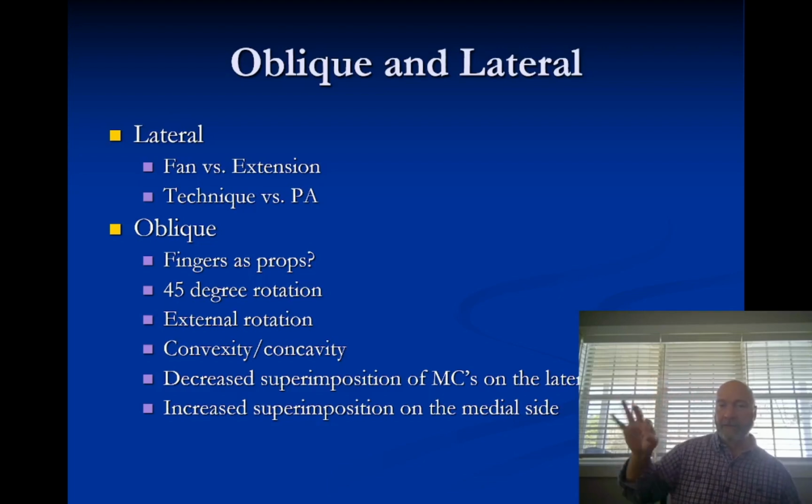Just have them touch and then separate the fingers just a little bit, but your fingers still need to be parallel to the image receptor. So don't dip your pinky finger down like that too much. Okay, so put it on the image receptor and fan the fingers out so that you can see individual fingers.